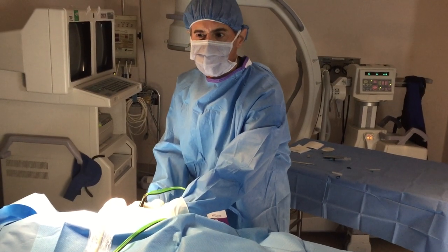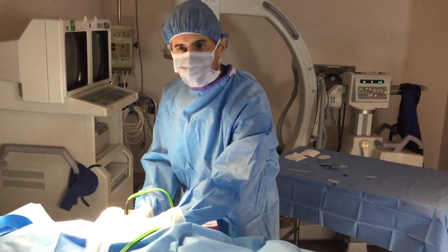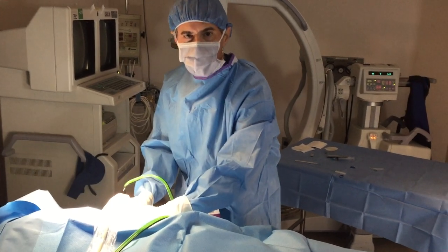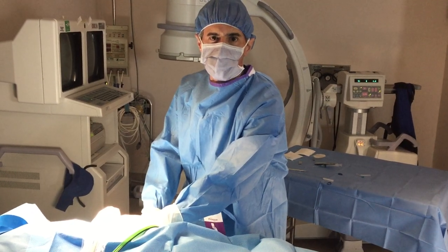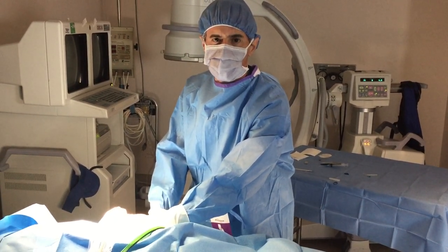This is the final steps of the procedure now. We're just aspirating, putting out some of the fluid, and we've done a good debridement. So this is an excellent treatment for patients with tendinopathy to avoid surgical intervention.